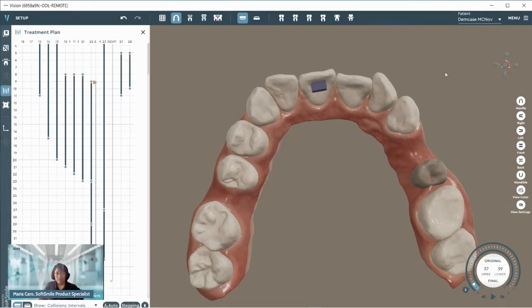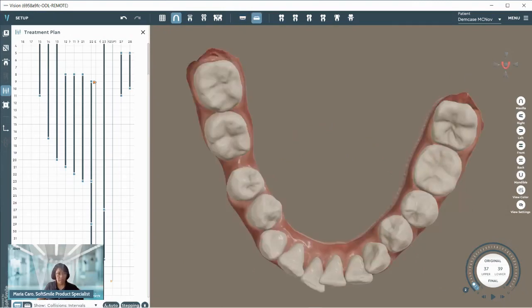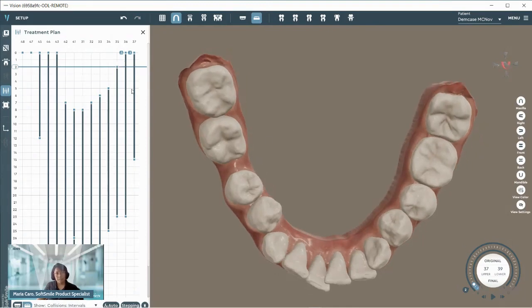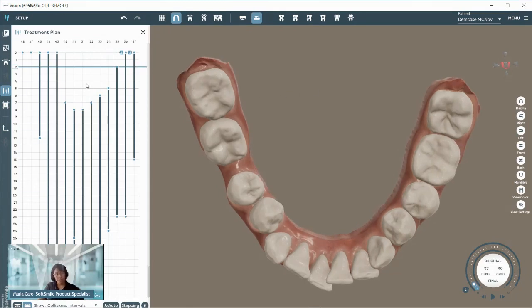Switching to the lower arch, take note of the two hexagons at the top — these represent our interproximal reduction. Once we've executed the interproximal reduction, it is immediately documented in the treatment plan. We have full control of the value of that IPR, and can add or decrease the amount. We also have full control of when we execute the interproximal reduction within the treatment plan.